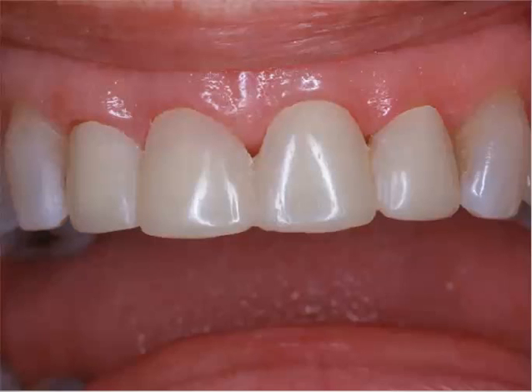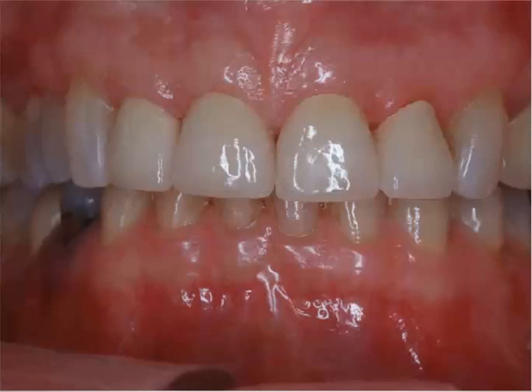We're not going to have problems of interproximal migration or hypereruption, and these are all splinted together. Certainly there is ease of removal and placement, but being all tied together, they won't have a tendency to drift or create any issues.